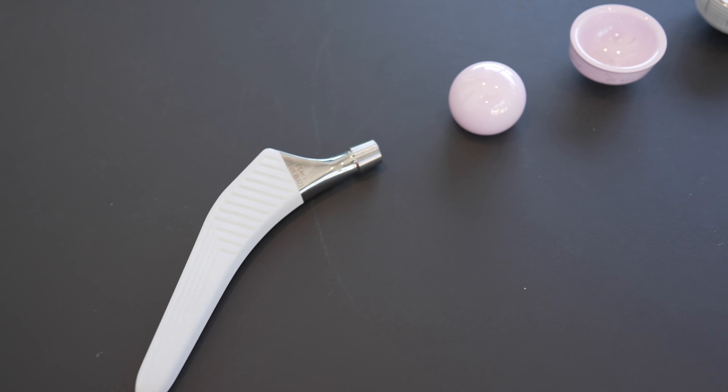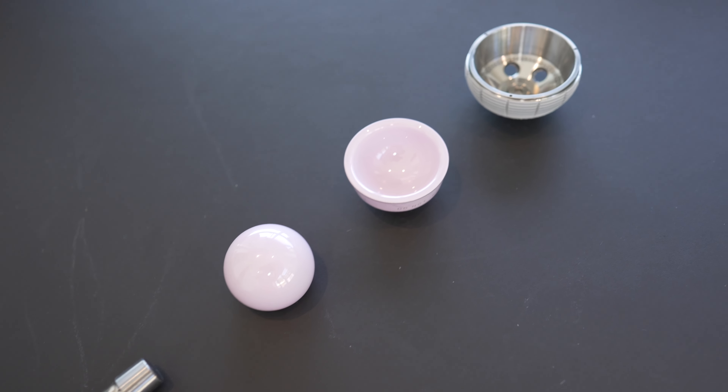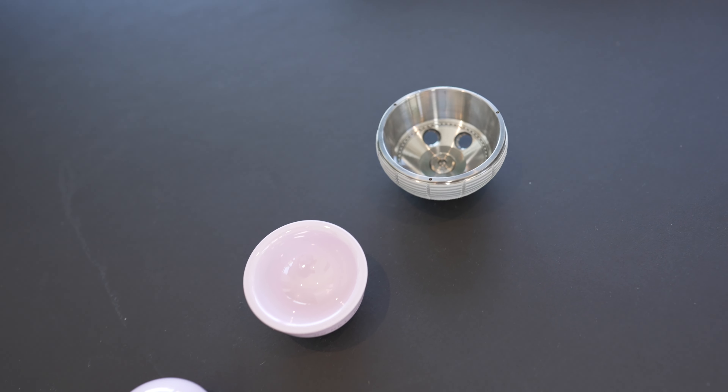A hip replacement is designed to replace the ball and socket with metal, ceramic or plastic. When I perform all of my hip replacements, the articulating surface between both the ball and liner are often ceramic on ceramic or ceramic on plastic.